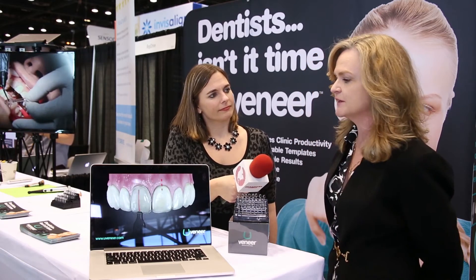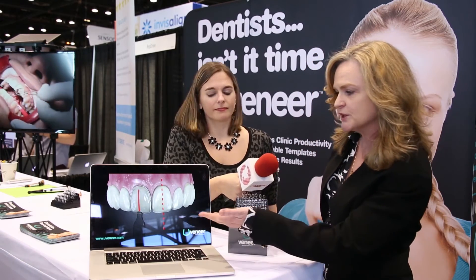I understand you have a demo for us. So you're going to place the composite material onto the tooth. We're going to select the correct template from the Uveneer kit and then we're going to press it into place. We like to call it press and cure. The nice thing is that when you cure your composite through our plastic matrix, you shut off the oxygen inhibited layer and that's going to cut down on finishing and polishing time. As you can see here, we have pressed it into place. We've taken our little midline to make sure everything is lined up correctly and then you just cure.